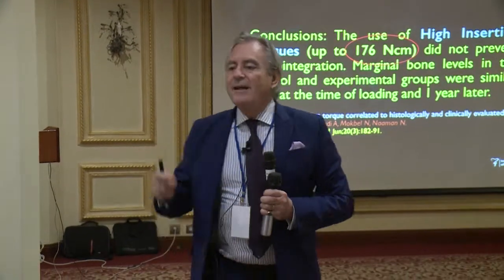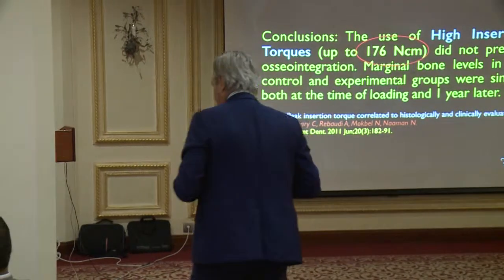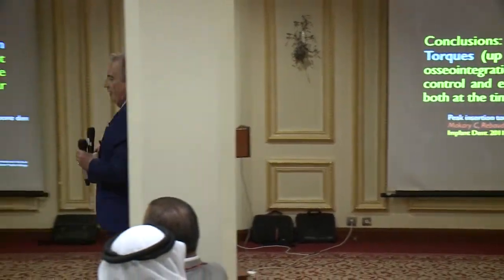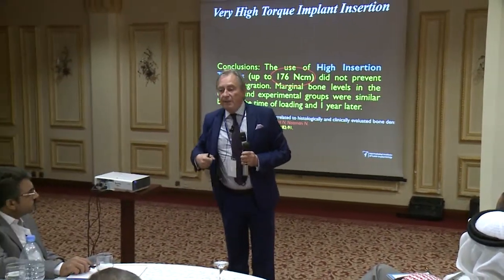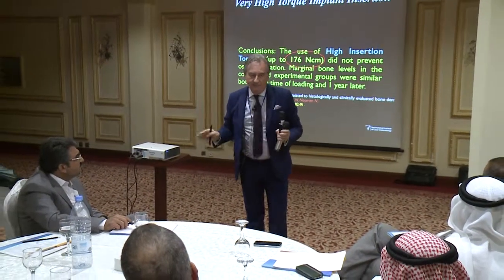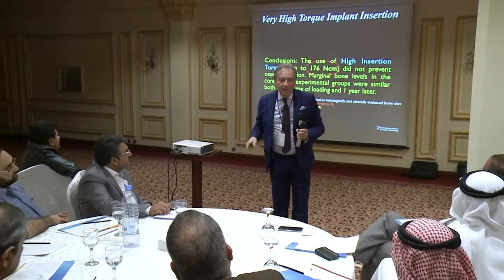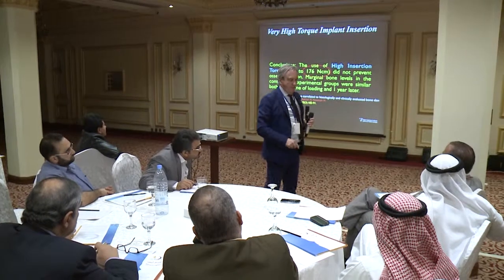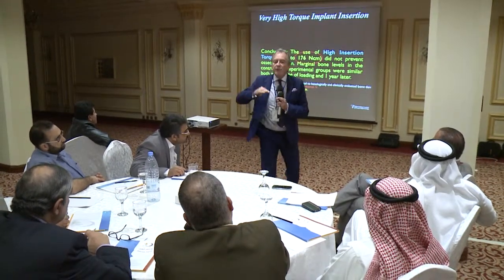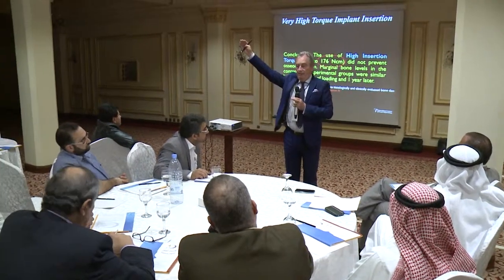176. Again, because I've been criticized for saying, yeah, you said that we need to apply 176. No, no. Not at all. This has been published. And this means that we can apply a high torque.